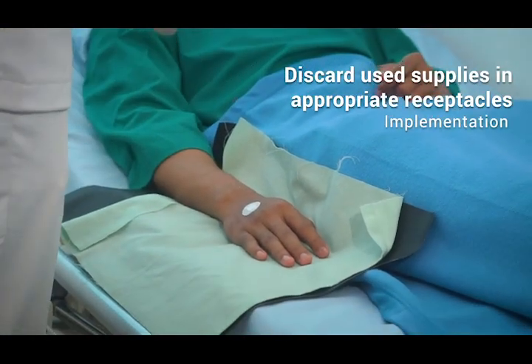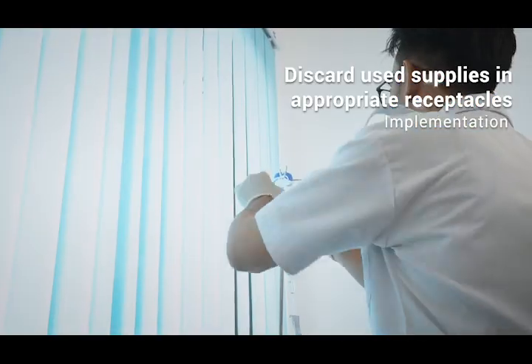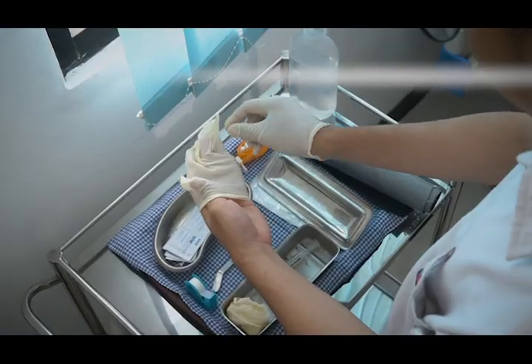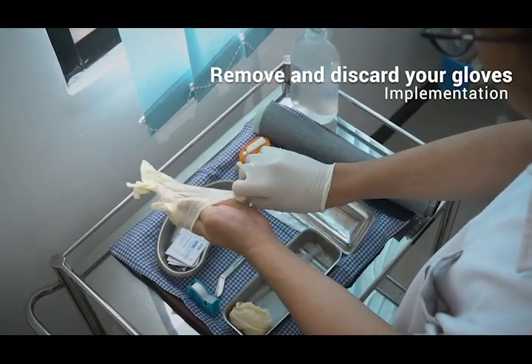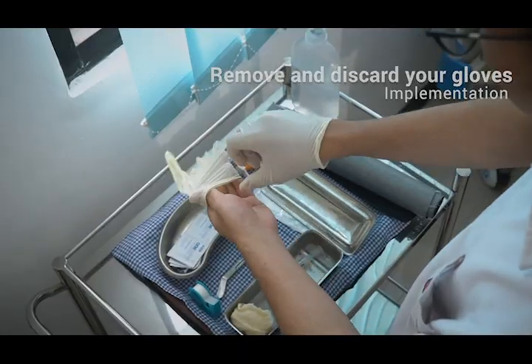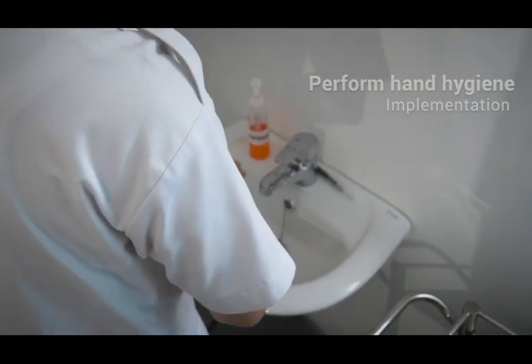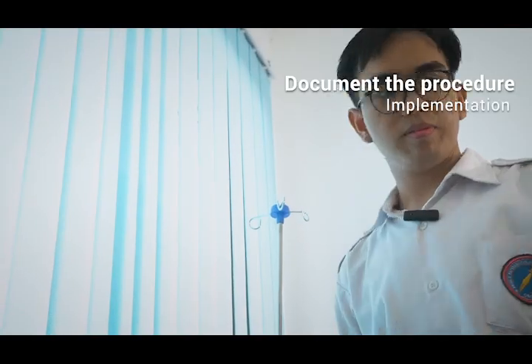Discard used supplies in appropriate receptacles. Remove and discard your gloves. Perform hand hygiene. Document the procedure.